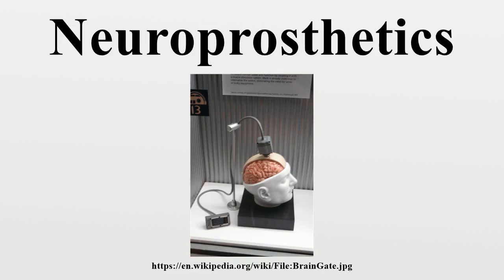In contrast to traditional hearing aids that amplify sound and send it through the external ear, cochlear implants acquire and process the sound and convert it into electrical energy for subsequent delivery to the auditory nerve. The microphone of the CI system receives sound from the external environment and sends it to the processor. The processor digitizes the sound and filters it into separate frequency bands that are sent to the appropriate tonotopic region in the cochlea that approximately corresponds to those frequencies.